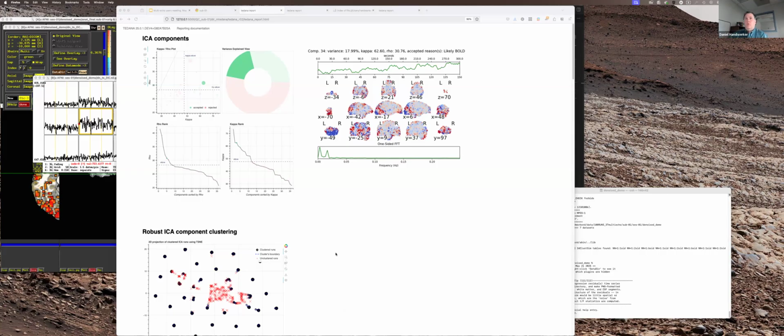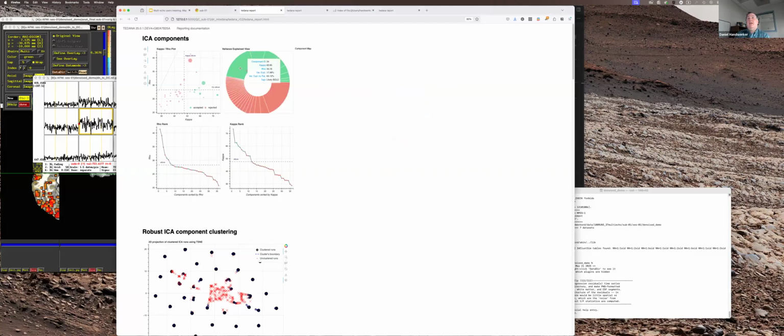So we know this has signal in it, so we should not remove it. But it is an issue. Maybe if you look at this later and ask, is the noise here mostly that linear drift, or is it something else? But it is what it is. You can flag it and say, I definitely don't want to remove this component, but I should know that it is a strong mix. On balance, it's going to give us better signal, and we don't want to remove something that contains robust task information. Did that answer the question?